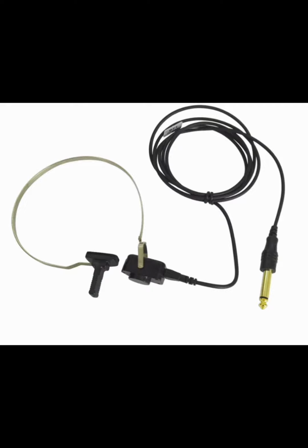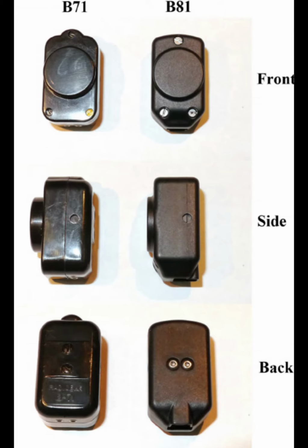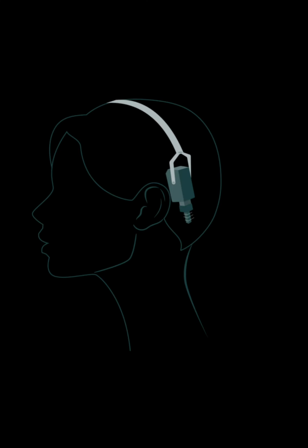Today we are going to discuss bone conduction testing. This is the transducer used for BC testing. Bone vibrators are transducers composed of diaphragms encased in plastic. During bone conduction evaluation, the circular vibrating plastic surface of the bone vibrator is held in contact with the patient's skull by the tension of a metal band.